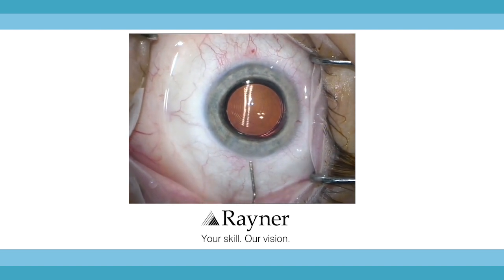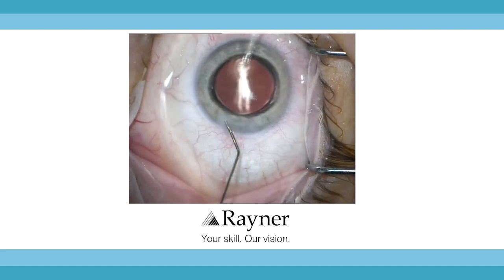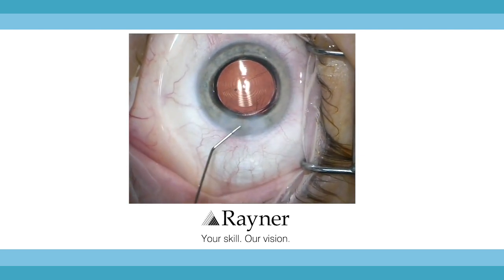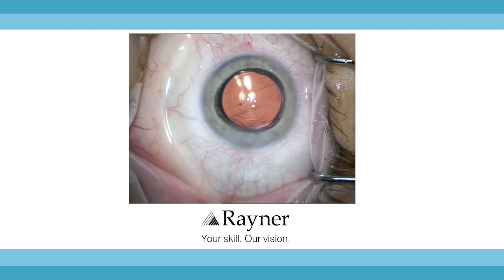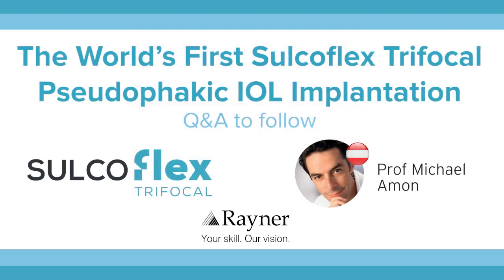I perform some hydration of the wound and finally I inject some antibiotic. This is the implantation of the world's first trifocal Sulcoflex lens. After this world's first implantation of a trifocal Sulcoflex, I am happy to say that the implantation was straightforward and without any complication. Centration of the lens was good and I hope that all cases in the future will end like that one.